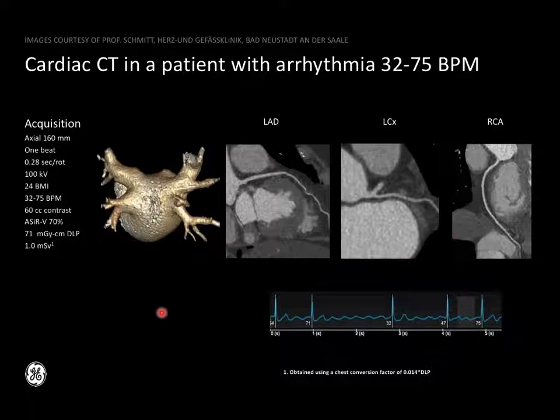That's particularly true in patients who have poor left atria, like dilated left atria and atrial fibrillation. Those folks' EKG is very, very variable. So it's hard to image them if you're trying to make images that assume each heartbeat is the same.